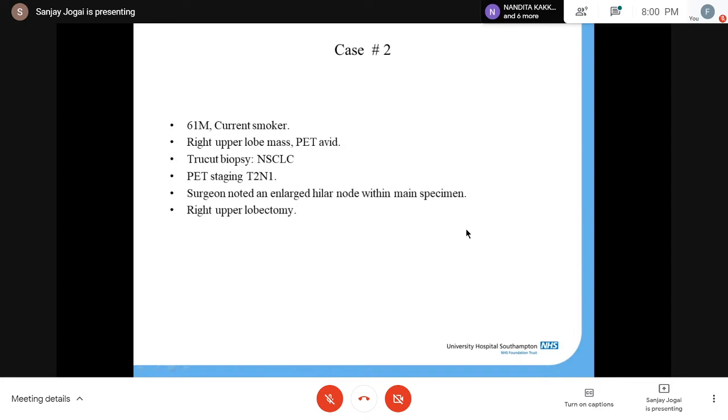If you are doubting something, this small cell, don't get disappointed if the synaptophysin chromogranin is negative. That is one area where CD56 is so useful. Even in a completely crushed specimen, if you see a CD56 positive, the clinician can treat. Yes. So if there are no more questions, please take the next case.